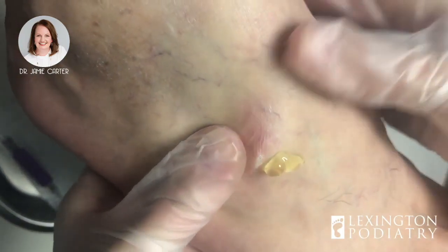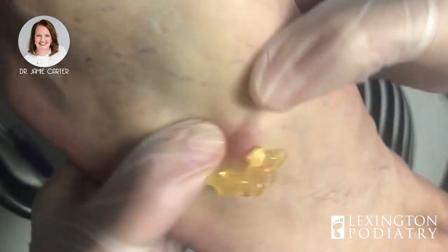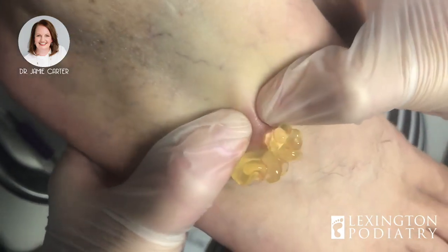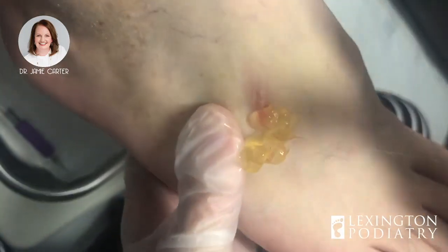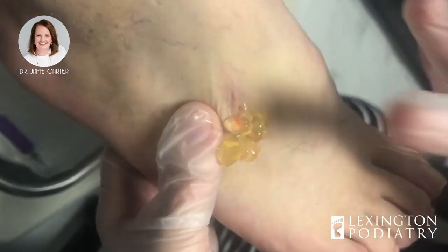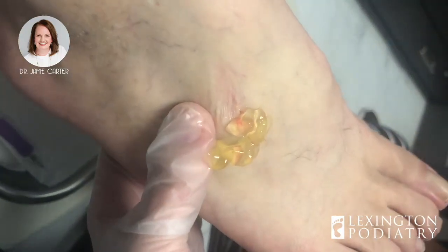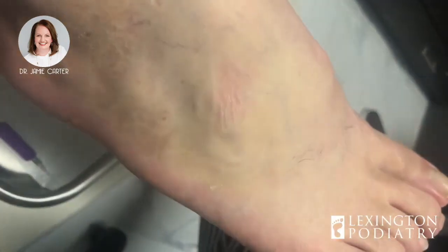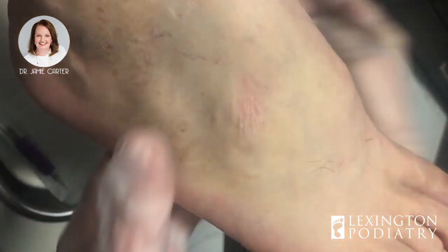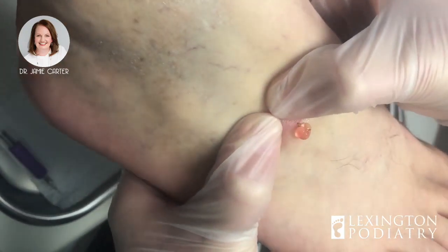Super cold — it freezes the skin. And that is ganglion fluid; it comes from a joint, so it is joint fluid. It's clear and looks like jelly — it's also very stringy and sticky — and that gives me all of the diagnosis that I need right there.